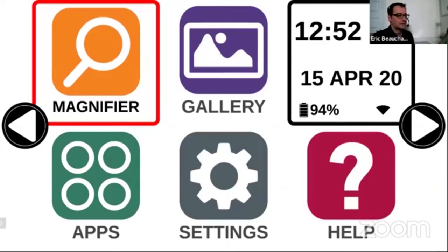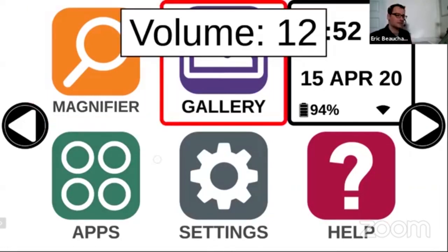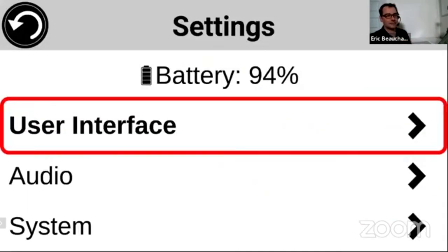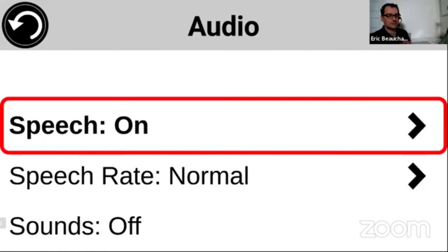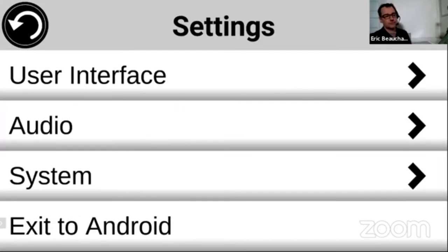There's a question, is the camera button now called magnifier? I also saw the distance button. Yeah, so magnifier is what you're going to use to see everything that's under the tablet. So it's going to use the camera that's under the tablet. So that's the magnifier. So you can pinch and zoom or magnify anything that's under the camera, your near view, if I can say.